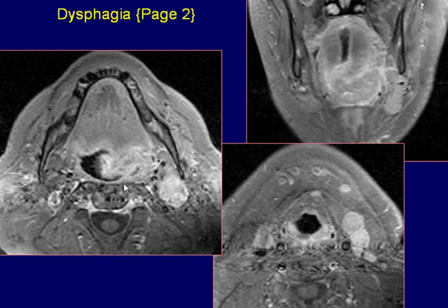Axial post-gadolinium fat-saturated T1-weighted image demonstrates slightly heterogeneous enhancement of the tongue lesion, and enlarged lymph nodes in the carotid space bilaterally.